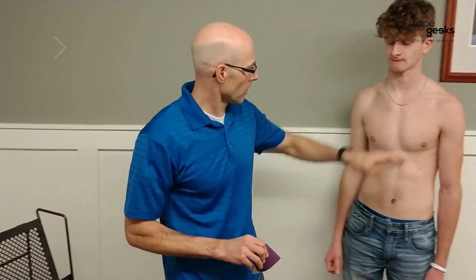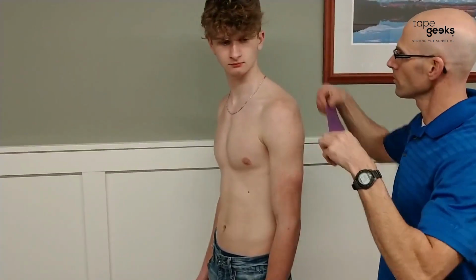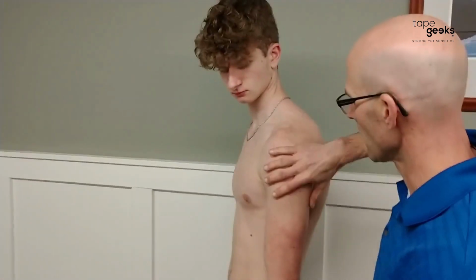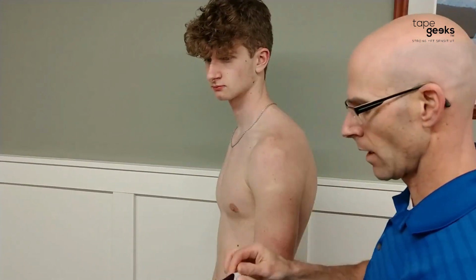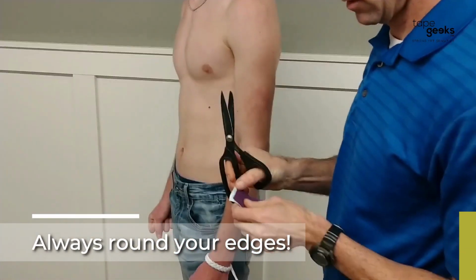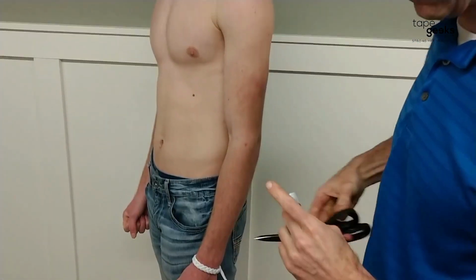Okay, so let's do some taping. Now, we're gonna use this shoulder because that's the one that's got the bad posture. A very common taping that I do that works often for many shoulder conditions is to help this lateral deltoid, to activate it, to help it do some work. So I bring a tape right up to here, I'll measure it, and then I'll cut it, just like we showed in the previous videos. And we're going to round the edges, again like I showed in some previous videos, so whenever you're taking your clothes on and off, it doesn't snag.